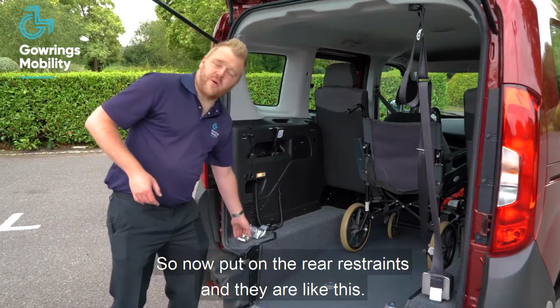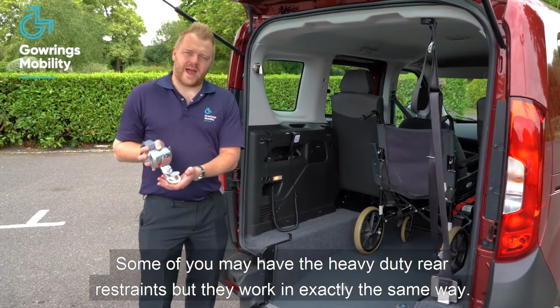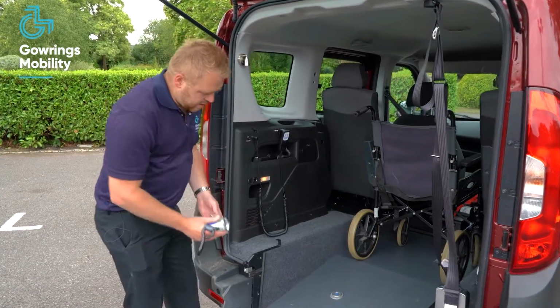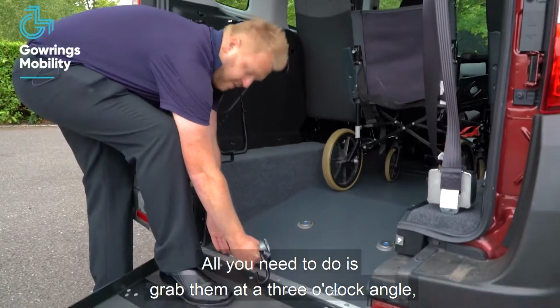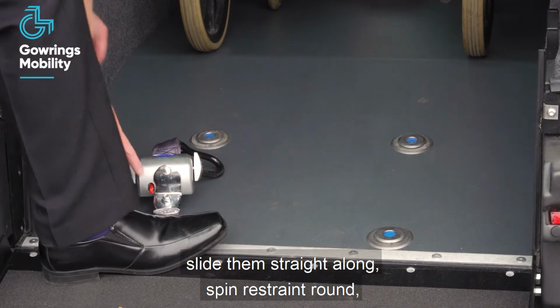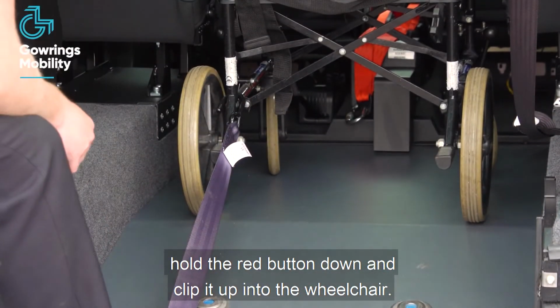So now is to put on the rear restraints, and they are like this. Some of you may have the heavy duty ones, but they do work in exactly the same way. All you need to do is grab them at a 3 o'clock angle, slide them straight along, spin it round, hold the red button down and clip it up into the wheelchair.